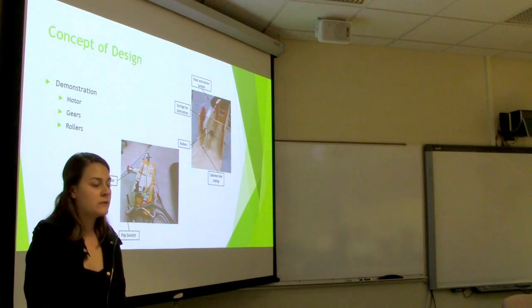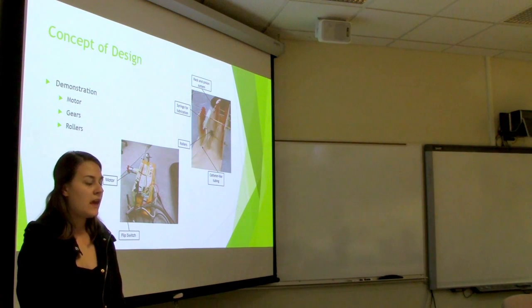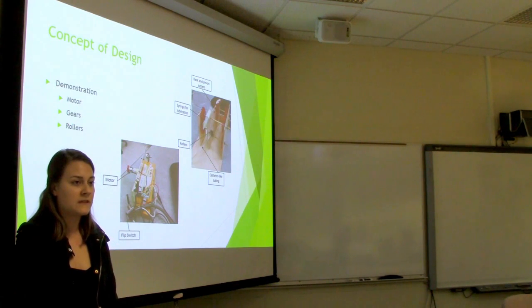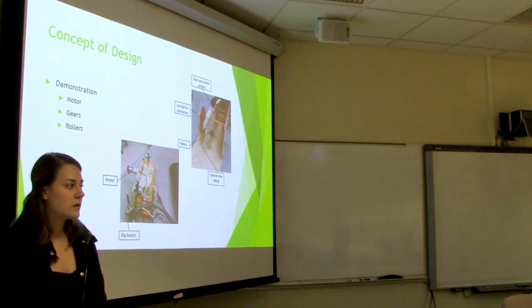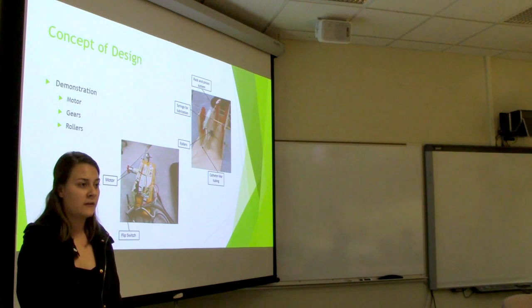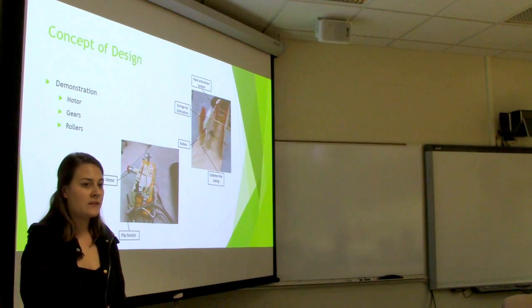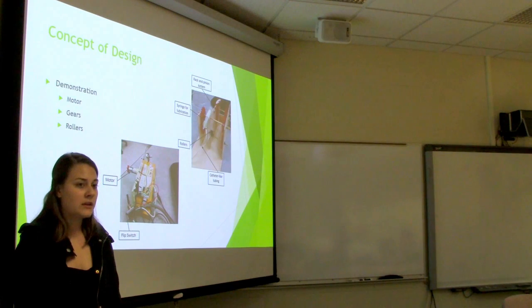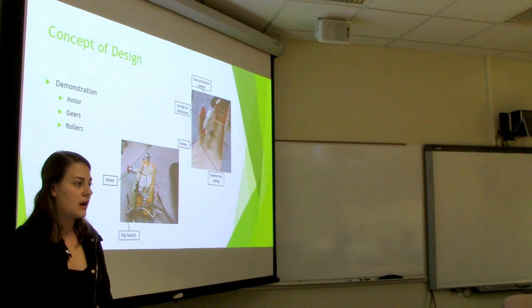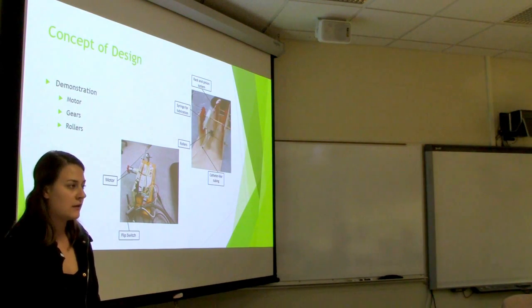From there, a gear train reduced the speed from the motor to what I thought was an acceptable feed speed for the catheter. And the catheter was pulled forward and backward using two rollers that moved at the same speed but in opposite directions. There's also a lubrication system included in the device because a catheter needs to be lubricated to go into the body comfortably. And I showed that in the demonstration using a rack and pinion system and a syringe. So as the rack is pushed forward by the pinion, the plunger of the syringe is pushed forward, expelling lubrication onto the catheter, making it ready for insertion as it comes out of the device.